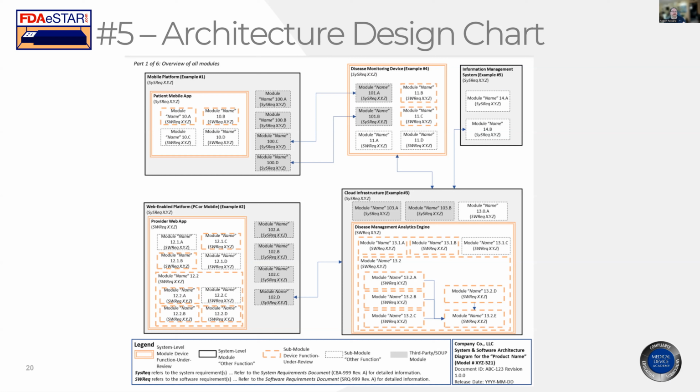And you also want to look at, whenever you do a change, you're not just going to retest that box, you're also going to look at the inputs and outputs as well. So you look a little bit broader than just the box where you made the change. You want to look at the inputs into that and the outputs and see if it affected those as well. So you do a little bit more retesting. A lot of times what we're doing is regression analysis to see what the impact is going to be and whether we need to redo the validation or not.